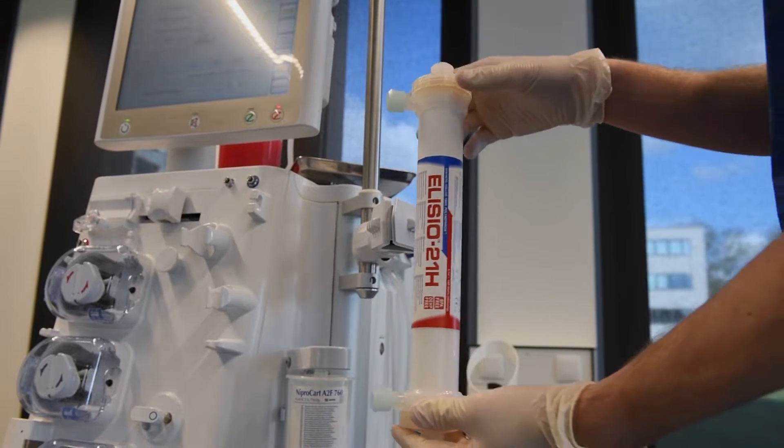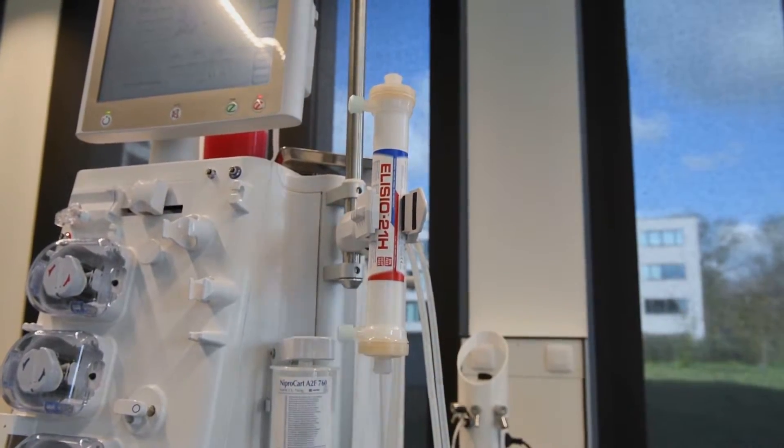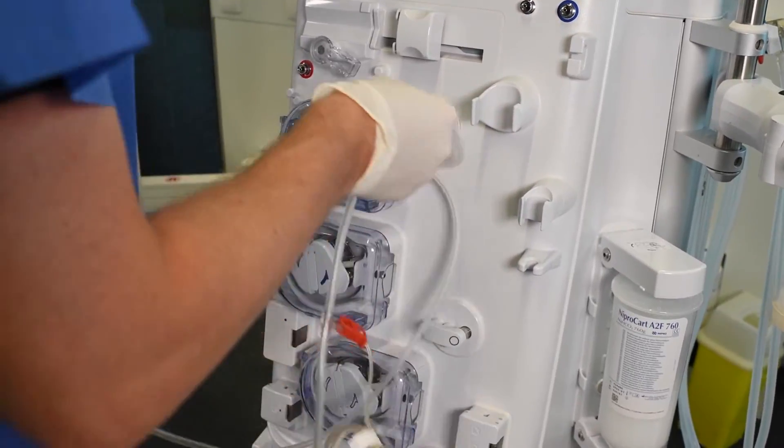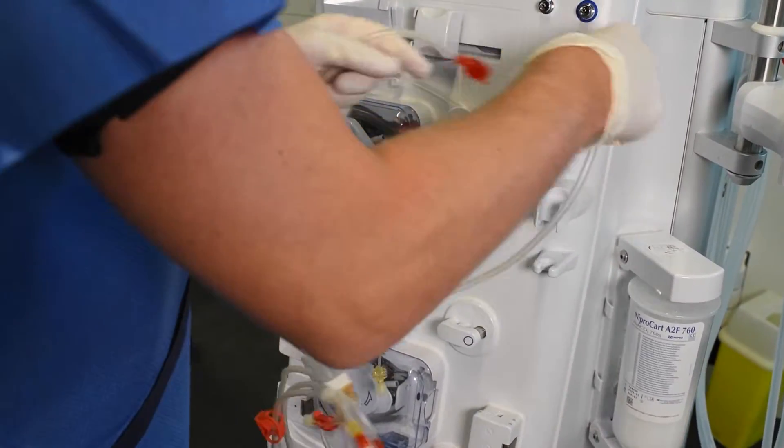Place the dialyser in the dialyser holder. Insert the arterial clip bottom first and click the top into place until you see and hear the click. On the screen, the setup for a standard bloodline will appear.